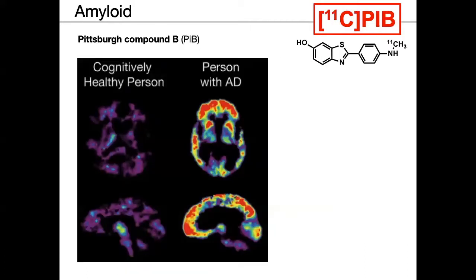And another example, this is actually looking at amyloid deposition now. There are a lot of newer tracers that also look at tau. This is really important in aging and in Alzheimer's disease. If you're familiar with it, you will know that there are depositions of these aggregated proteins in the brain, and we can image them with specific PET ligands.